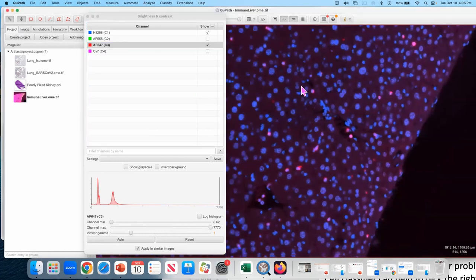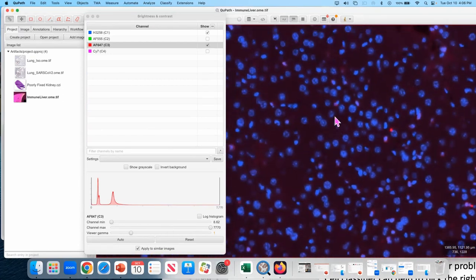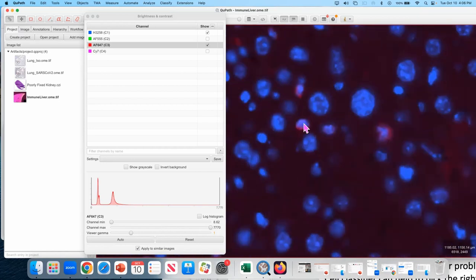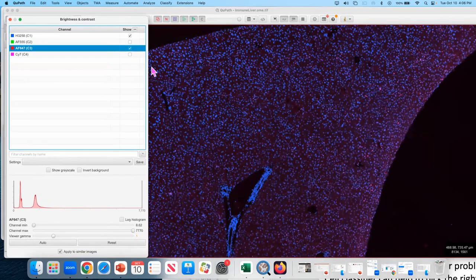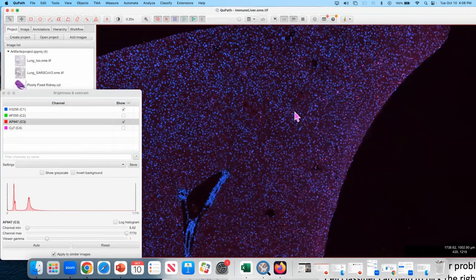But when you move deeper into the tissue, you can also find some cells that are neutrophils, but now their overall intensity is much dimmer. So if you try to find a single threshold to classify them as positive or negative for that marker, you may have some difficulties. Out of the tools that you've seen today and tried, what tool would you use to deal with that problem, to teach the software what is true and what's wrong?